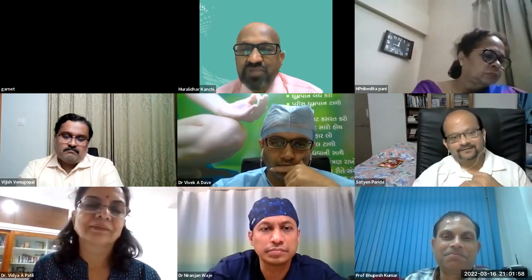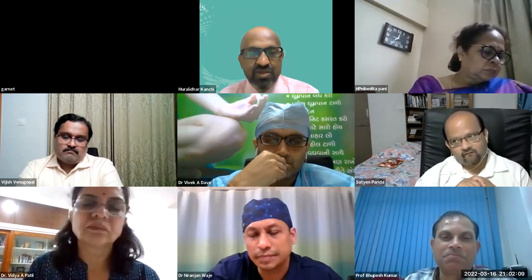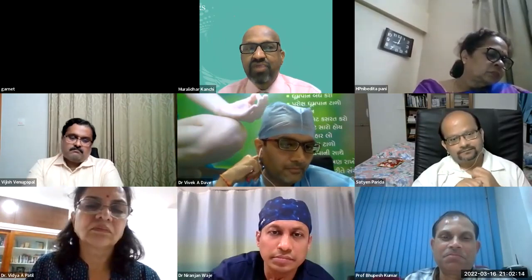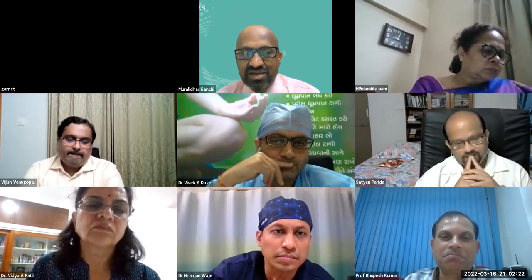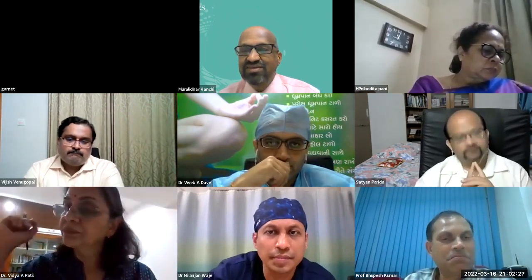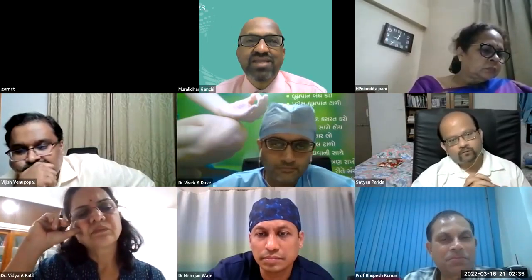You mentioned prospective studies. What we should do is use the HPI index, that is the hypotension prediction index, when you are tapering inotropes in intensive care units. The best advantage is whether we can fairly quickly turn down the inotropes or not. We should know by looking at the hypotension prediction index. It has not been studied. That is one area which has not been explored.